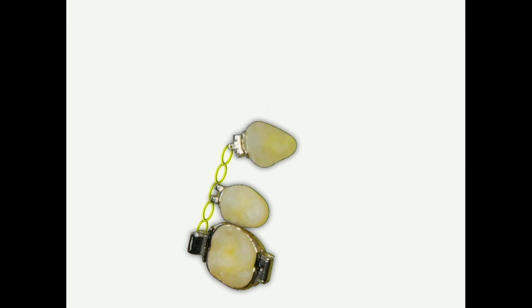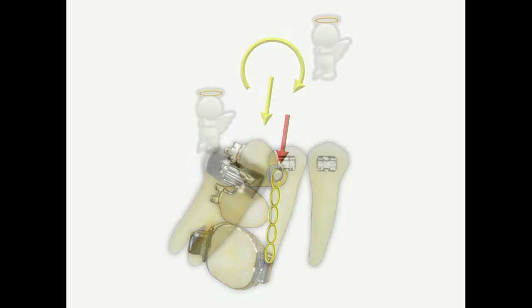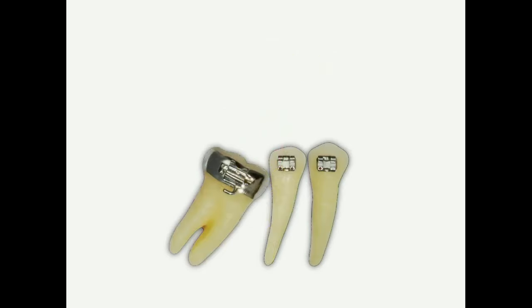That means inconsistency cannot be eliminated by application of a single force on the labial side. In this case, the point of application is moved over the center of resistance and placed on the lingual side. Now, both force and moments are working in the correct, desirable direction, and the force system becomes consistent. This is a frequently found situation when the first molar is lost.